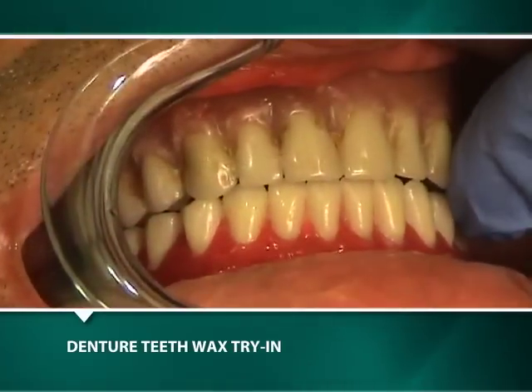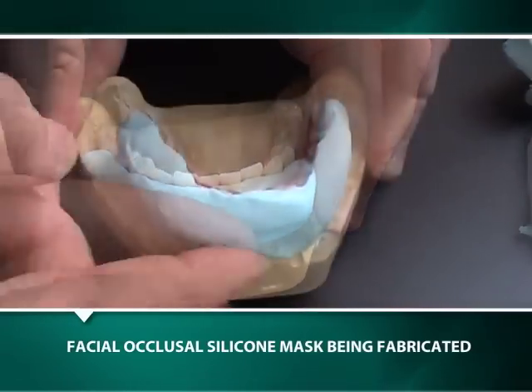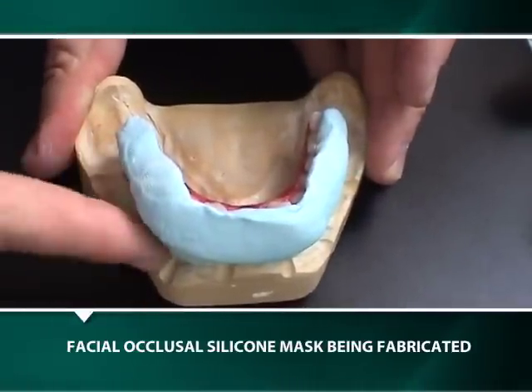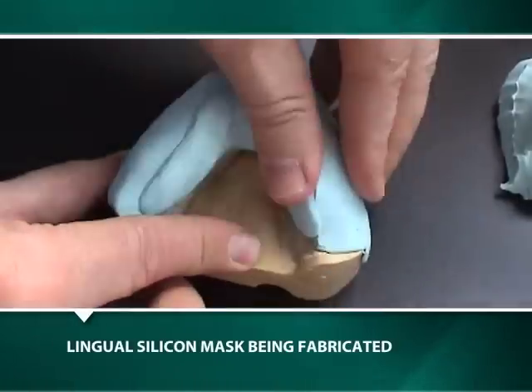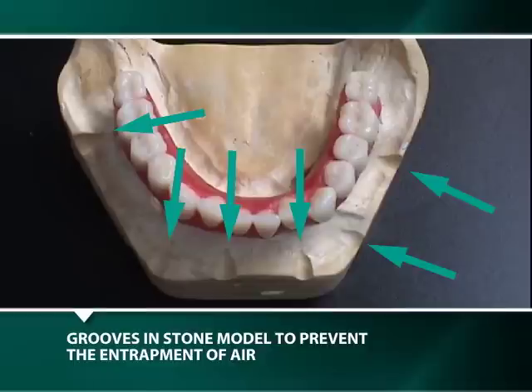Once the denture setup has been clinically approved, a facial occlusal silicon mask is initially formed over the denture wax setup. Prior to forming the lingual silicon mask, indexing or alignment grooves are placed in the facial occlusal mask. After fabrication of the lingual mask, grooves are cut into the stone model to prevent the subsequent entrapment of air when acrylic is poured into the silicon flask through an anterior cutaway or aperture in the lingual mask.